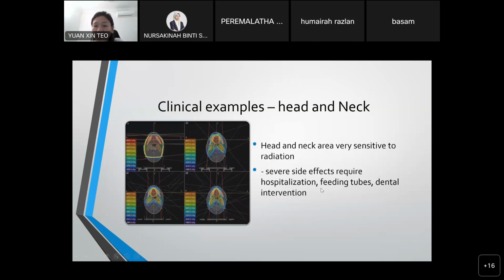Then the doctor will ask them to insert a feeding tube, as you can normally see in dramas or TV. So the patient will have a feeding tube inserted through their nose. Then they will feed the patient by using the tube, which means they will put the milk through the tube directly to their stomach.